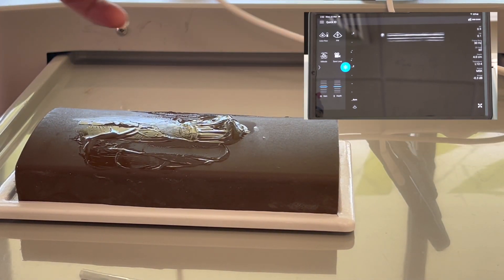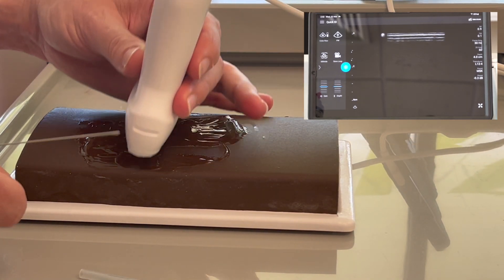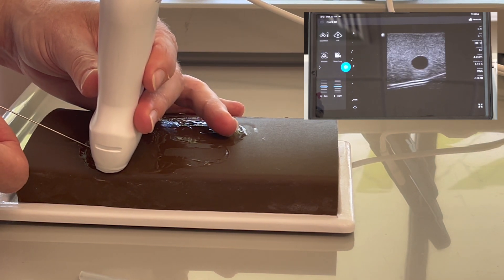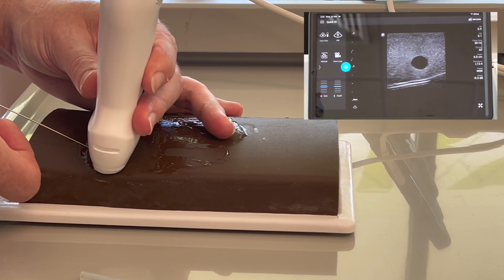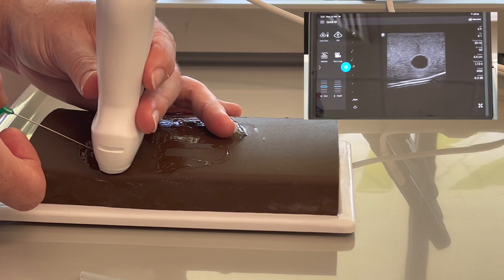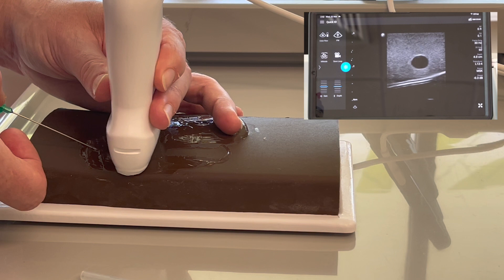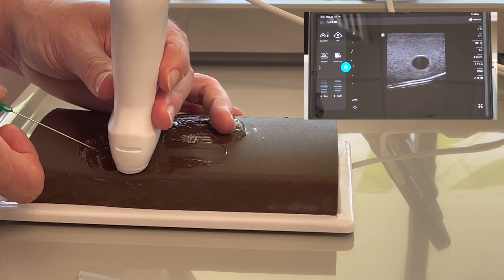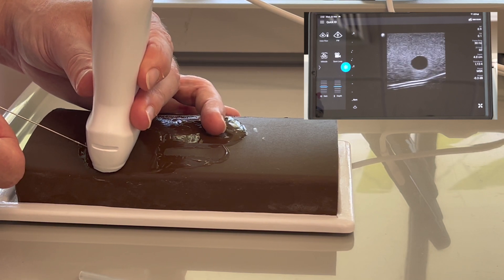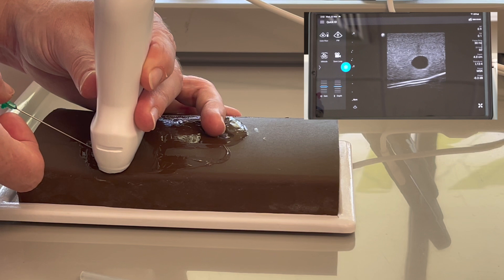With the out-of-plane technique, make sure that your probe left is your patient left, again two to three millimeters back from your probe. The downside is your ultrasound is unable to distinguish between the middle of your shaft and your needle tip. So as you can see, I've lost my needle tip. At this point, bring it back to the skin and start nice and gently until you get a flash of needle tip.